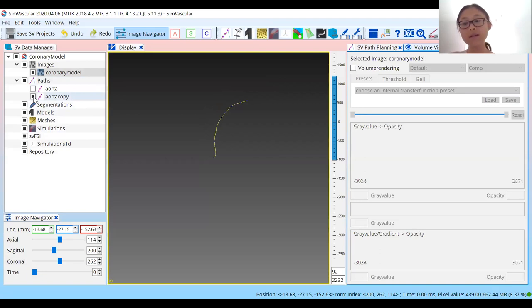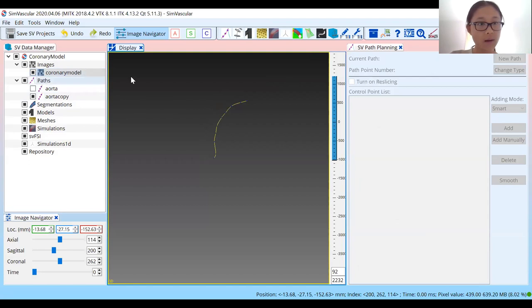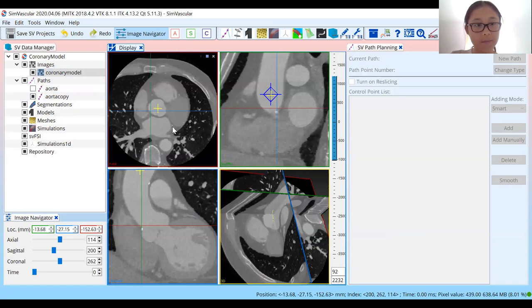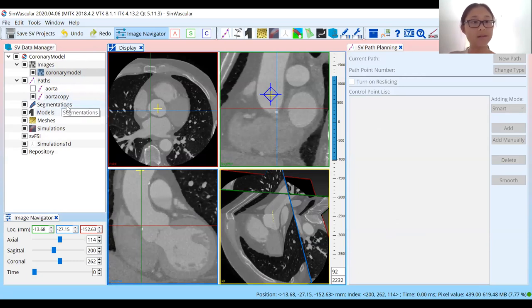You continue doing this path planning for all the vessels. One helpful point I'll include here is how to find the bifurcation points. I'm going to go back and turn on the crosshairs. Sometimes it's helpful, when you're starting a new path, to remember: every time you start to plot a new vessel, create a new path. Otherwise, when you get to the later steps like segmentations, the contour groups, the lofting previews, they won't show up properly.